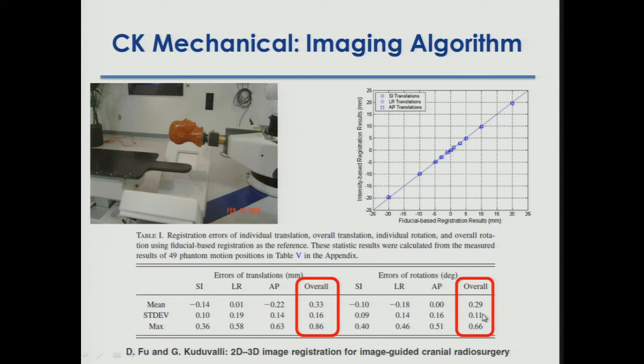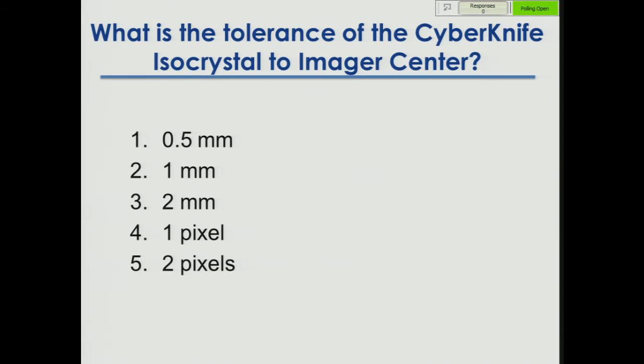This is a wonderful test. And it's probably one of the most underutilized tests, I believe, in the area of image-guided stereotactic radiosurgery. How often do we check the performance of our image guidance algorithms, not on BBs, but on something that's realistic and closer to the patient?